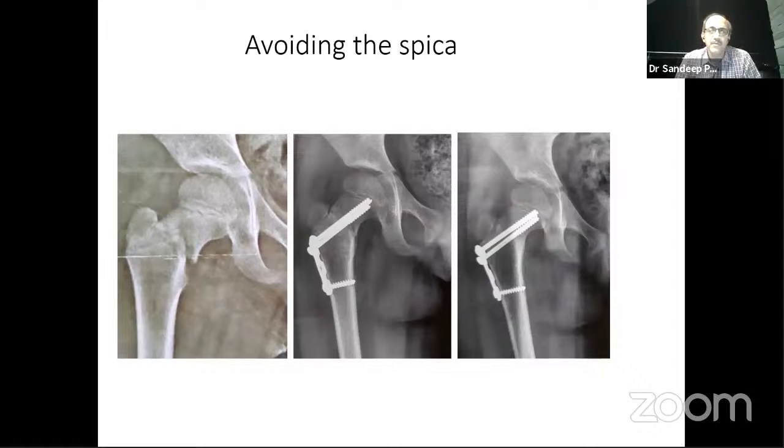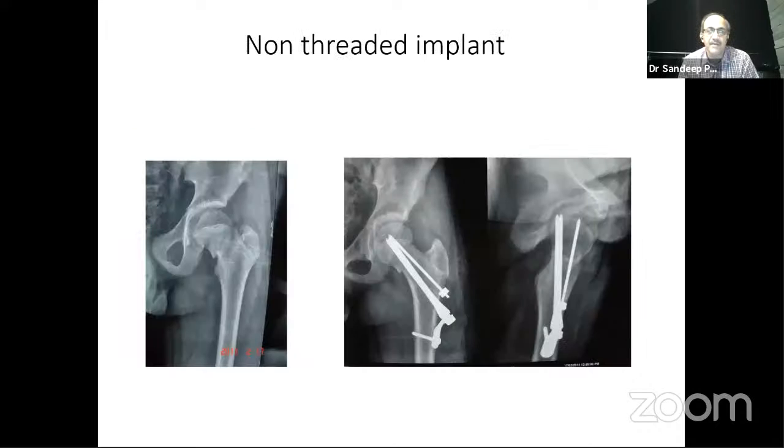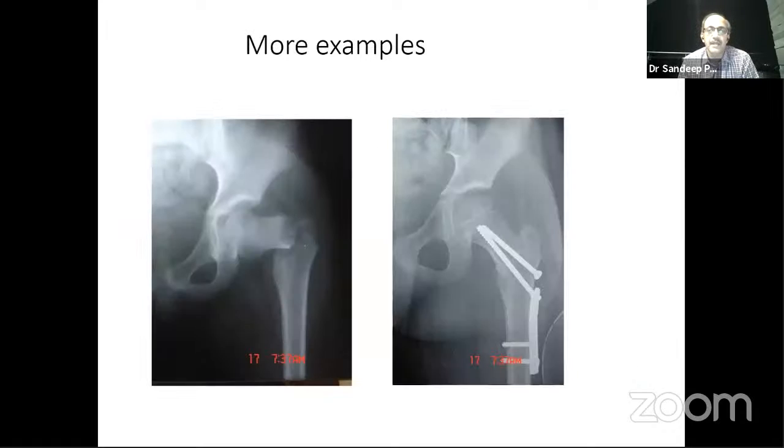I have developed my own technique for avoiding the spica. I use a side plate. So I use one screw after the reduction, which is a standalone screw, but the second screw goes through a small recon plate or a DCP, and you can see that I give a long leg knee brace and avoid the spica, and we haven't had failures with this particular side plate fixation, which helps us to rehabilitate the child faster. So these are a few examples of how we do a better, stable fixation.